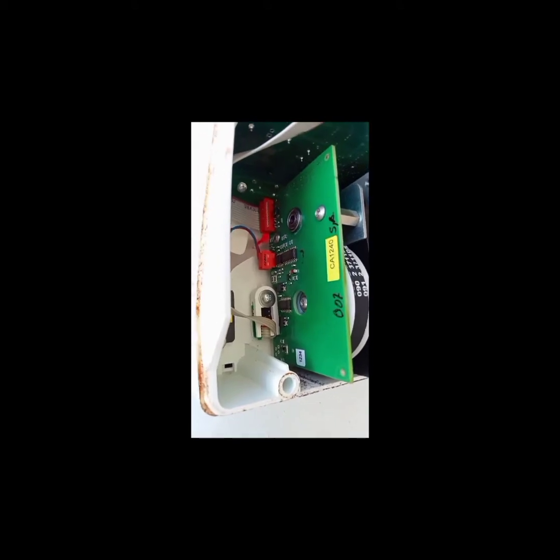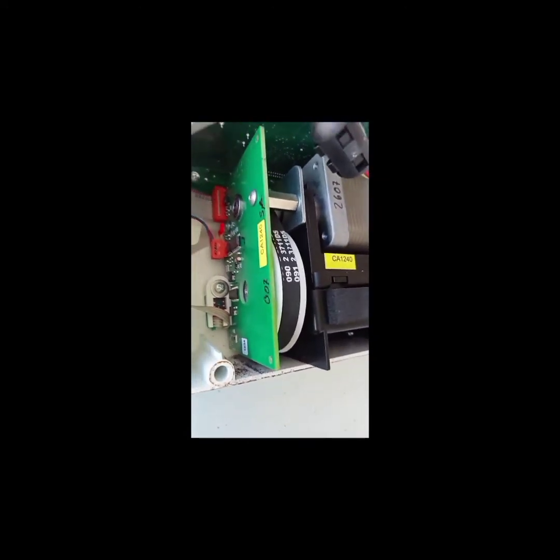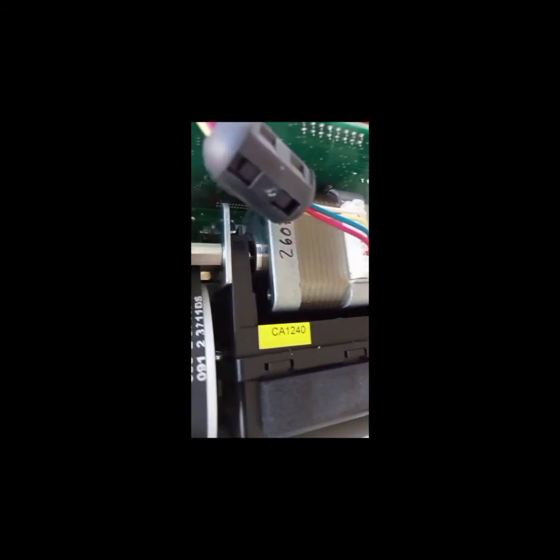As you can see in this portion, there's a circuit board embedded on the mechanical side. This is where the ADES board is being controlled, or the sensors here are being embedded. And as you can see, the connections, those red and blue ones, are connected to this portion right here, and the other one. I think those two sensors are the tubing sensors right here. We do not have to manipulate this one.